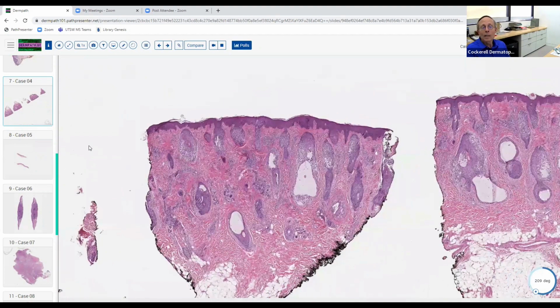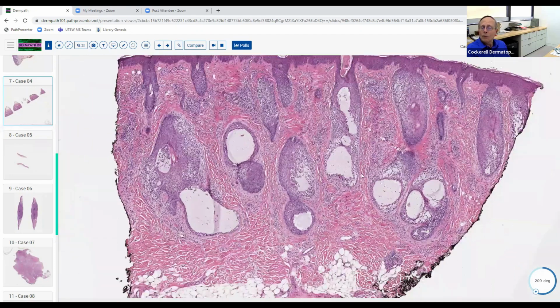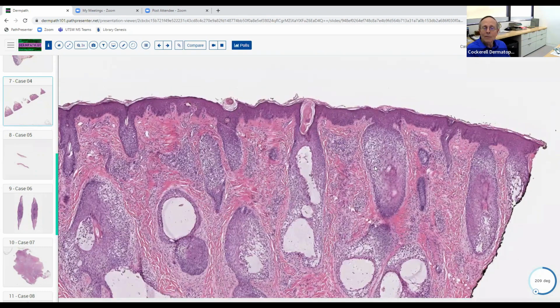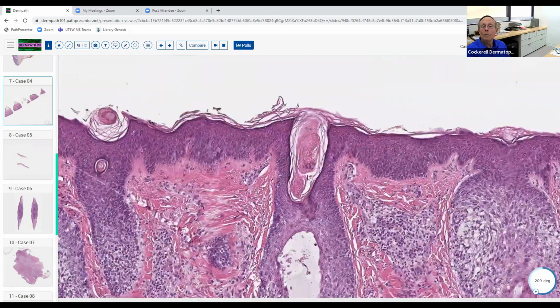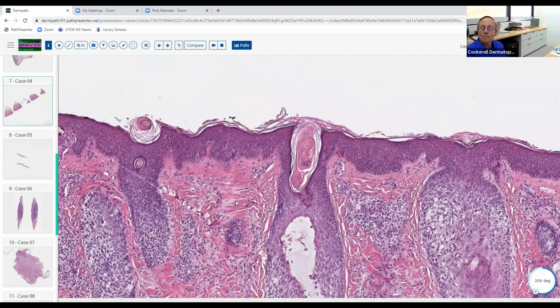And this is another case where you can very easily see this on the board examination. If this were MF, what do the lesions usually look like clinically when they have this histologic pattern? This is a good example of showing that right here. You see like kind of a follicular accentuation or erythema. Yeah, you get these little follicular papules that are almost like spines, and they have this cornified layer coming out of the infundibulum like this very commonly.